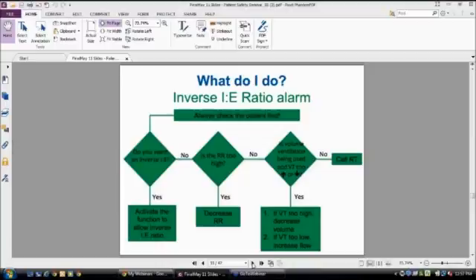Volume ventilation being used, and your tidal volume is too high or too low. If that's the case, you just simply need to come up or down with that on your patients. Again, it may be a case of you're trying to blow off some CO2 on your patient when they first came in, and now they're more compliant and blowing things off better, and you don't need that necessarily high or low of a tidal volume as you did when the patient first came in.